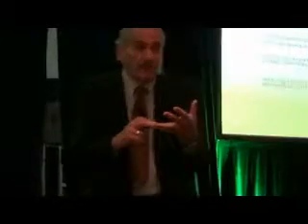We have to categorize the lesion. And I made it easy for myself. There are only 3 categories. Medial disc, lateral disc, central disc. It doesn't have to be herniation, derangement, dehydration, loss of elasticity, subluxation, but it's how you test the patient that determines what position of the 4 protocols you're going to put the patient in, together with the visual pain scale.